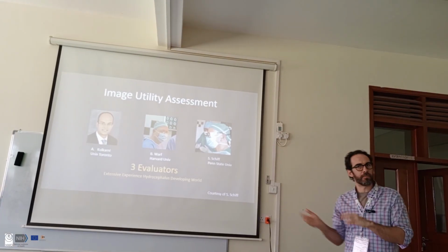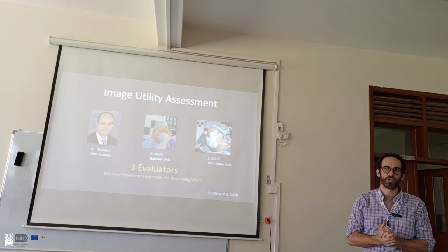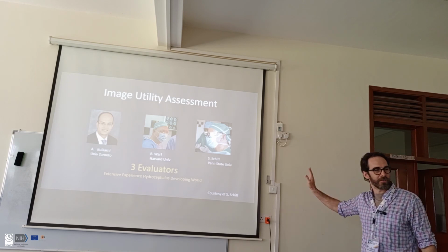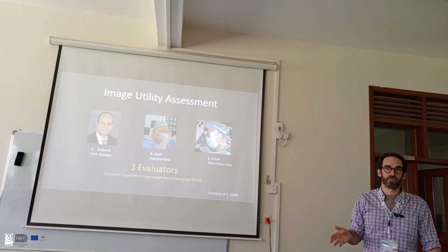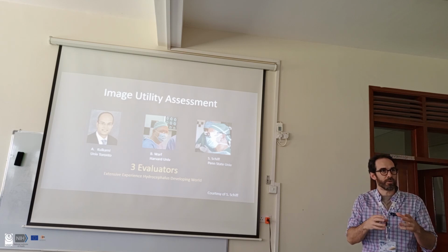So this could also be a potential bias in the data, which you should be thinking about. If we show this to neurosurgeons from the Netherlands or the United States, they would probably say all these images are terrible, I'm not using any of them. And they could be right, but they have access to the technology to make good images all the time. So it's a little different in terms of what you might be willing to work with.